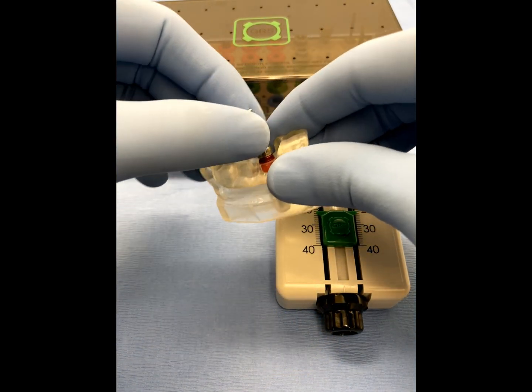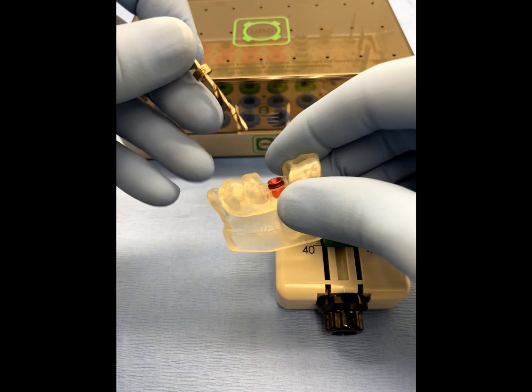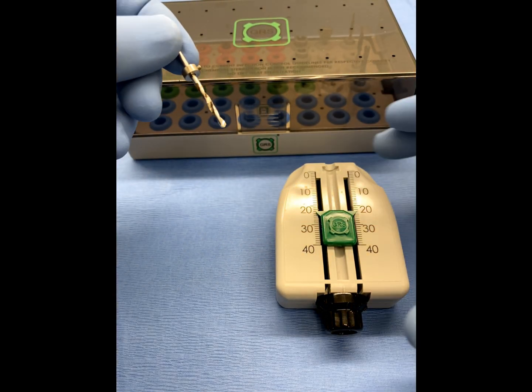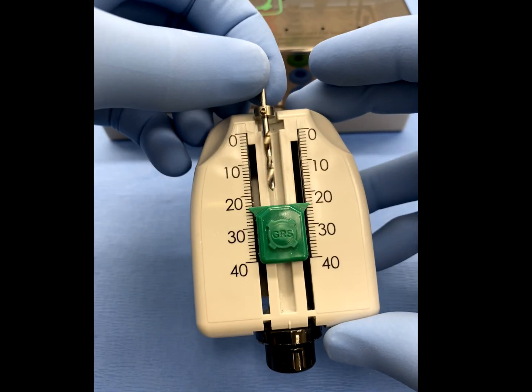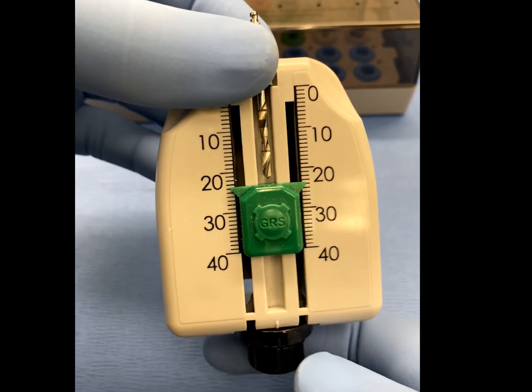Now, remove the drill with the affixed drill stop from the GRS surgical guide and model, and place the drill into the GRS depth gauge with the drill stop secured within the drill stop channel.